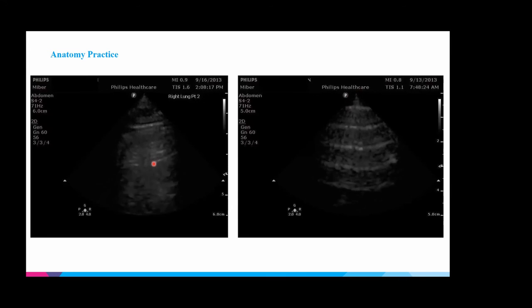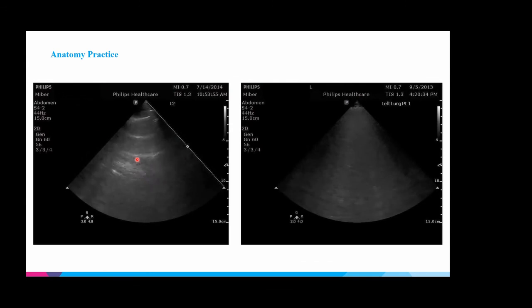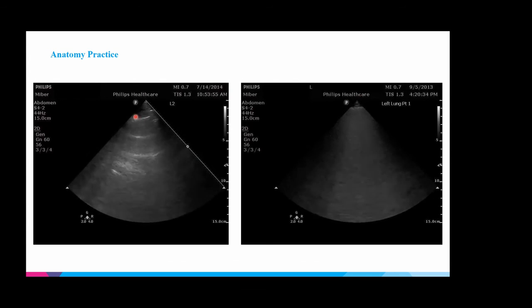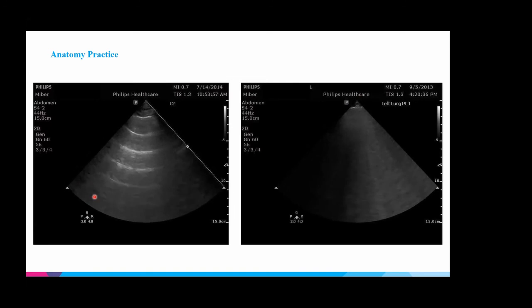That we'll just probably discuss in sim if you haven't gone through the cycle yet. All right, and then what are we seeing in these 2 clips here? So this first one on the left, A lines with some A line pattern. So I see the pleura right up here, right? And then there's maybe 1, 2, 3, 4 A lines. And then do we see anything else?